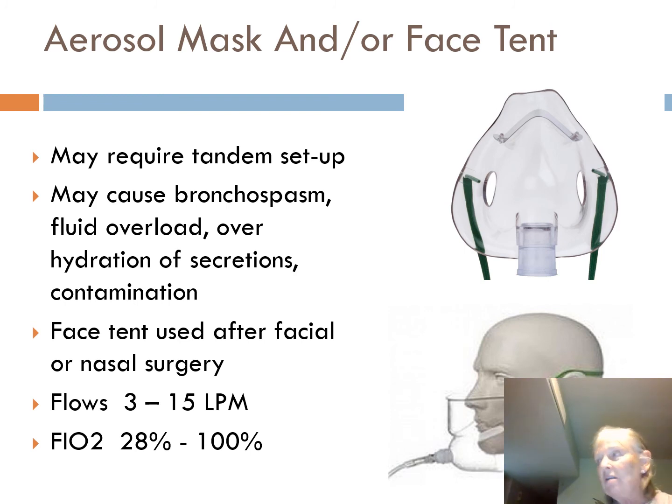There's a pediatric tent, an adult tent. Haven't used them for quite a while. What they sometimes look like, if you've seen those great big boats that are down in the Everglades, and they have that thing at the back of them, and it spins, well, you have to set up the arms of the tent, and it sort of looks like that too. Someone once said when we were talking about this, is that we probably haven't set up a tent for at least 20 years here in Tucson.